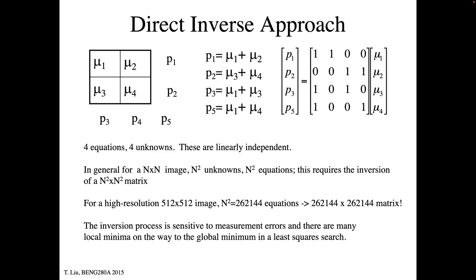But my prediction is long before that, deep learning is going to just take all of this out of our hands. You will just give it the raw data and say, what does that picture look like, given the 9 million pictures you've reconstructed in the past? And it will just give you the picture. Any inversion like this, like a Fourier transform or any kind of transform, you could teach a deep learning network to do on noisy data. Because you can create data and just teach it and teach it until finally it just knows how to do it really well. And it's cheap. Once you've trained a network, well, this inversion is super expensive. It takes a really heavy duty computer at the scanner about an hour, whereas deep learning would take something like 12 seconds to give you an image.